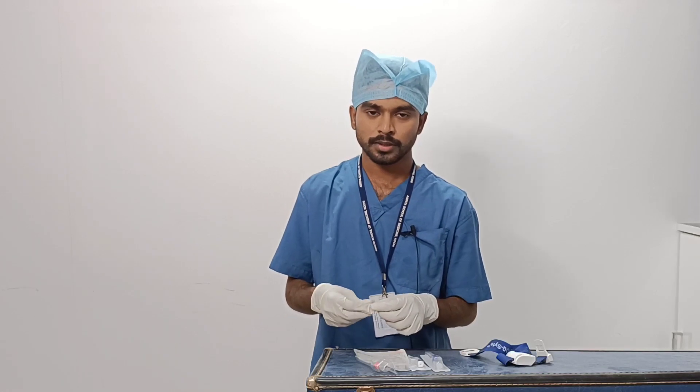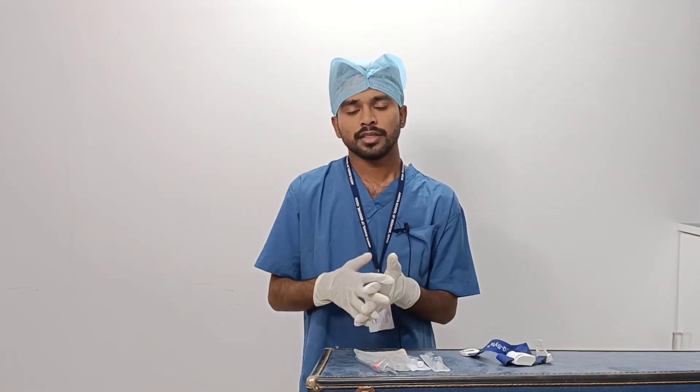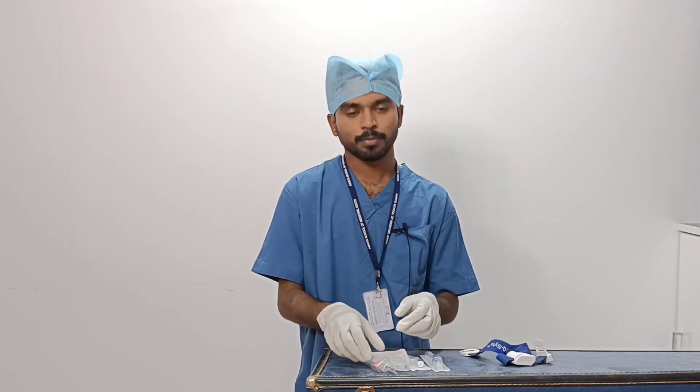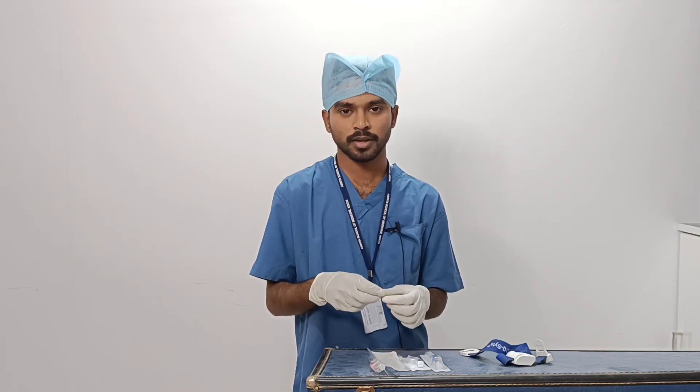For the procedure, whenever we are performing it, we must wear personal protective equipment — that means gloves. We have to explain the procedure to the patient and take verbal consent, explaining the possible risks and outcomes and what we will be doing.